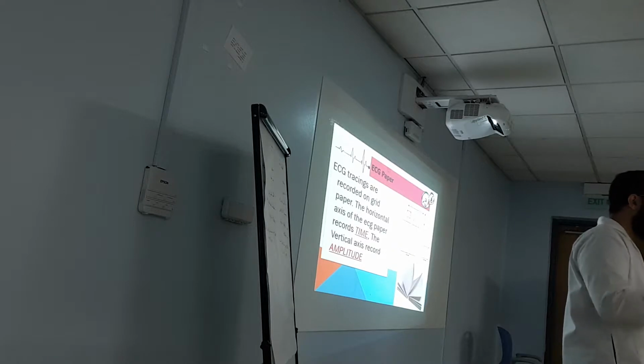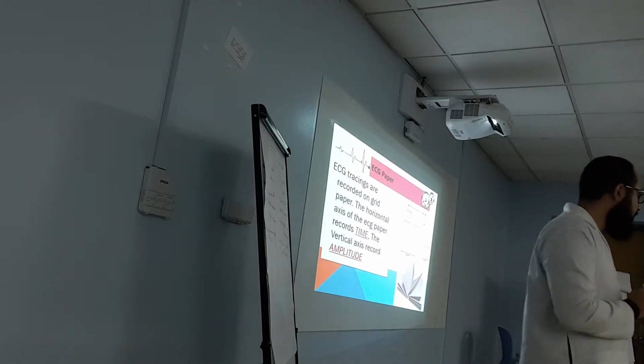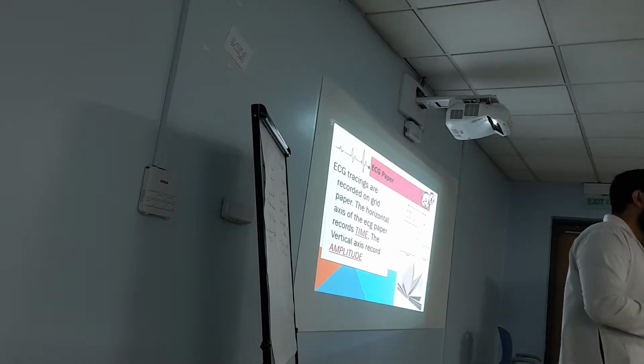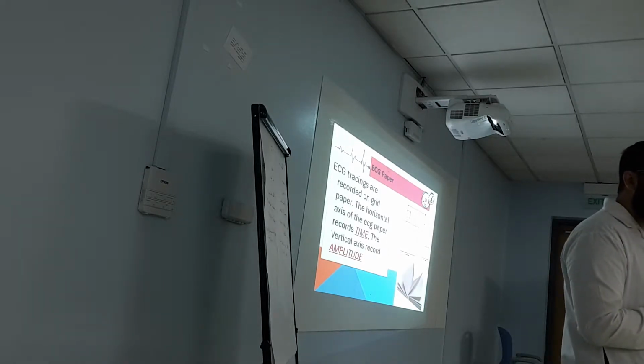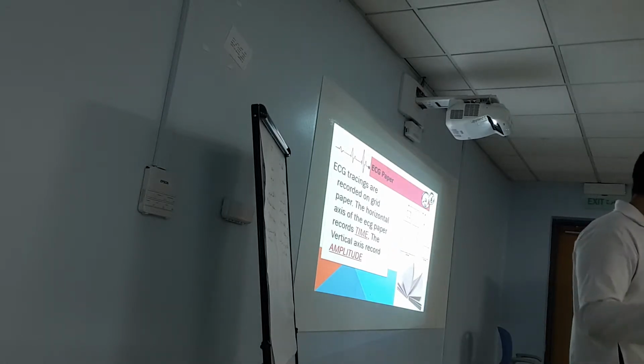Yeah, this is normally for one cycle. We're talking about a range always, not only one number. Remember, anything in human anatomy, human physiology, there is a range. So you are measuring from the P wave until the end of the T wave, right? I think it's 0.8. So how much? Let's say up to how much?